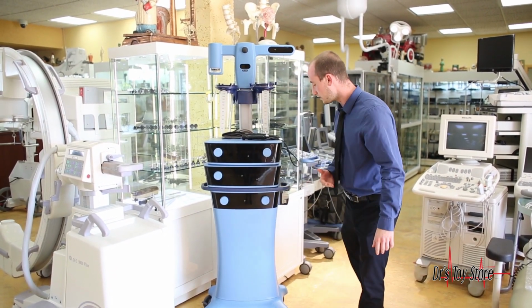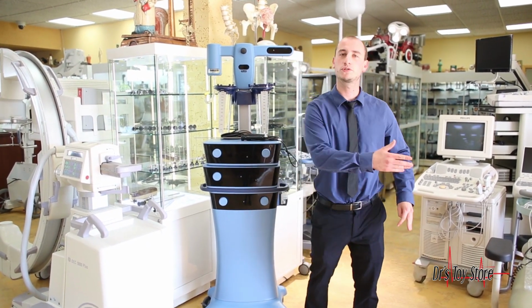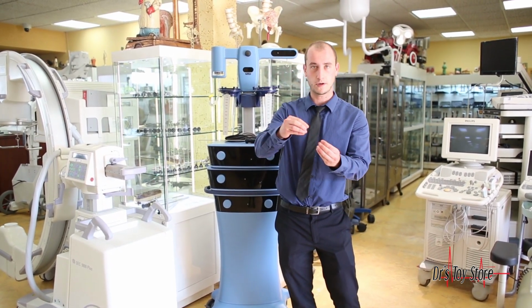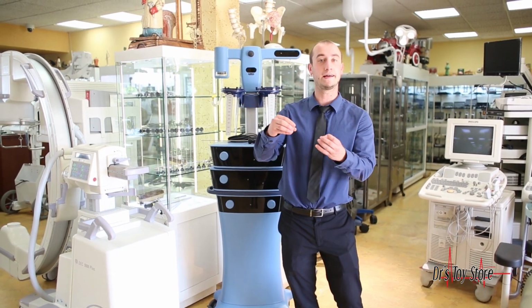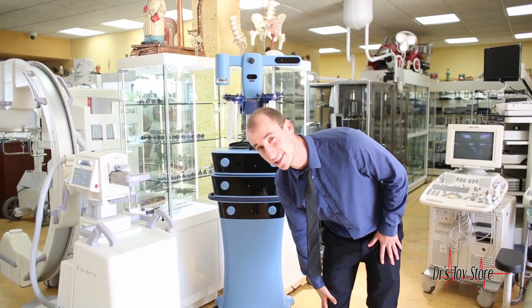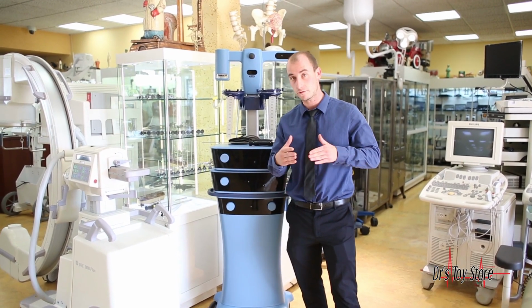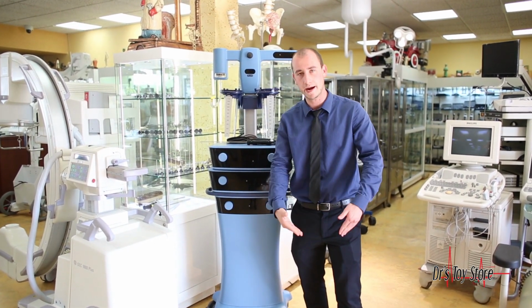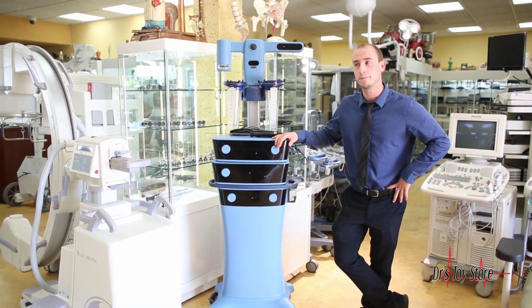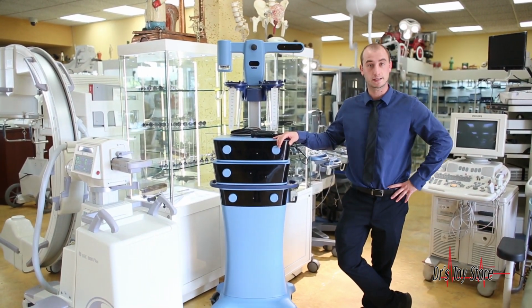That is actually taken out of the body using regular suction after using the VASER to emulsify it, put into a centrifuge. The centrifuge spins, it disassembles pretty much the fat and the stem cells, and you're left with this paste. That paste can actually be re-injected into joints, re-injected into the face, and all those dormant stem cells are actually differentiated into that tissue, and they begin to repair and regenerate that tissue. You can also use platelet-rich plasma mixed with the stem cells to further your regenerative process.